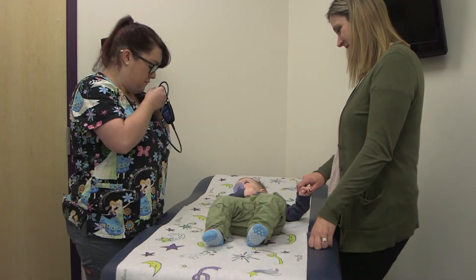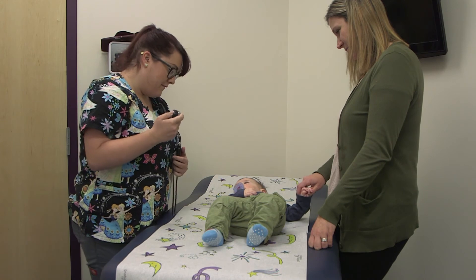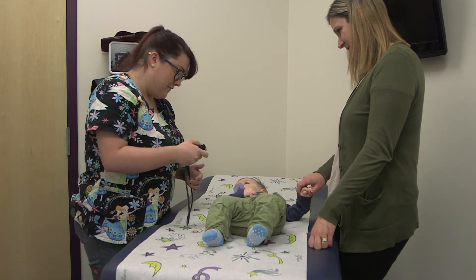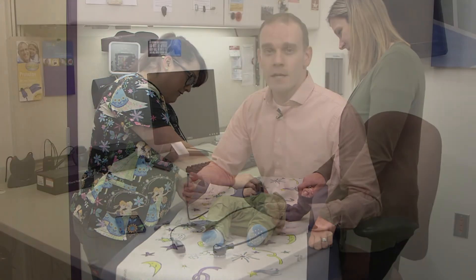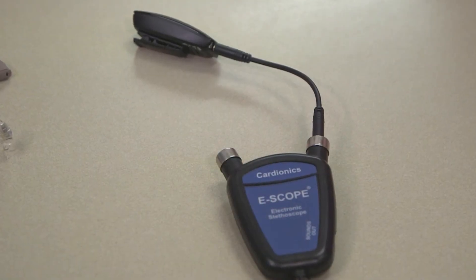This allows the medical professional to switch from a conversation with their patients to checking the pulse of the child or the person they're serving, and it's a nice fluid way of doing that with little interruption. If you're working with a healthcare professional who needs to listen to a stethoscope throughout their work environment, consider this as an option when you're selecting hearing aids for your patients.